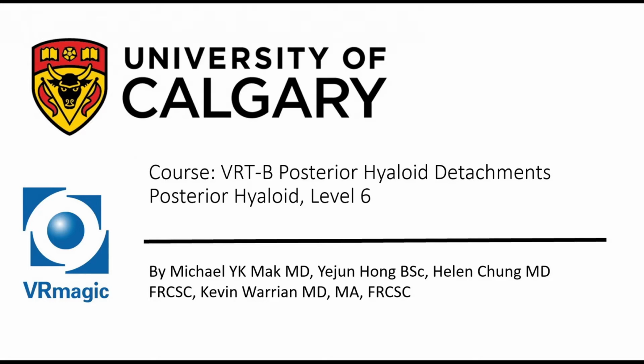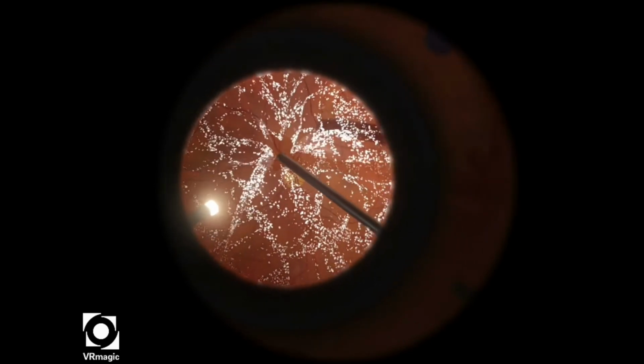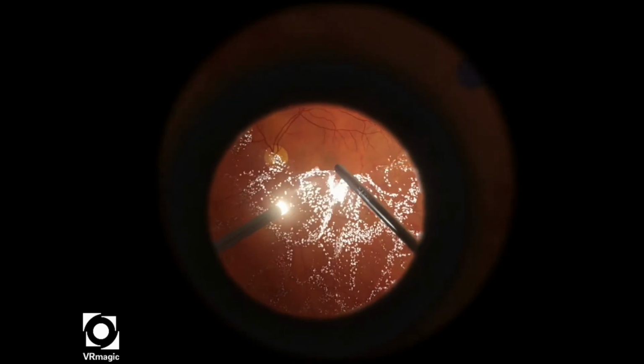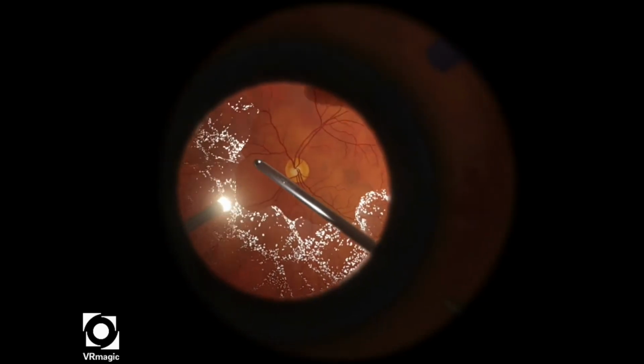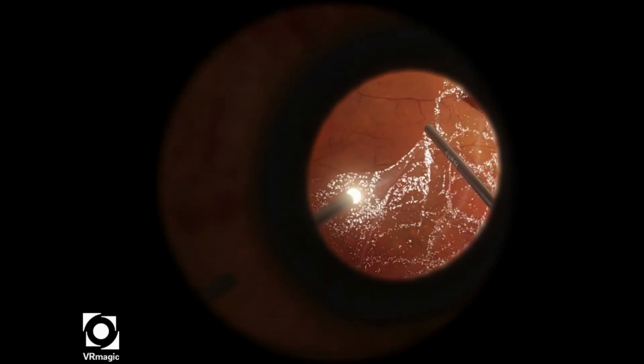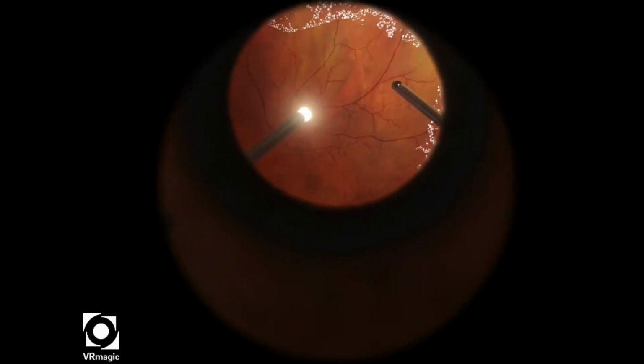B, Posterior Hyaloid Detachments, Posterior Hyaloid Level 6. In this particular level, your job, again, is to remove as much of the vitreous as possible, but there's a time limit, and the vitreous is a little bit more adhesive compared to the previous levels. So here I'm just creating that vitreous skirt so that I can advance it to the peripheral retina.